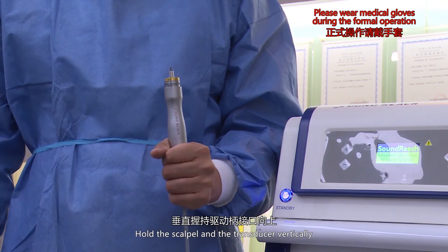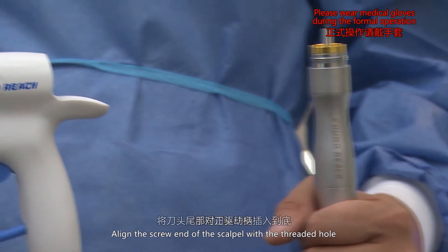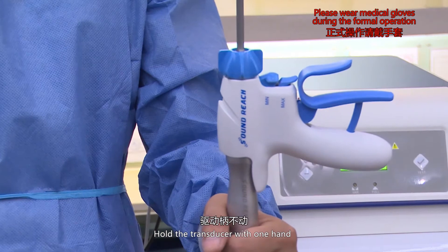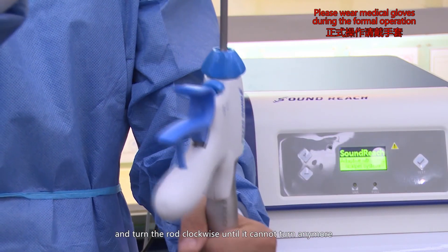Hold the scalpel and transducer vertically. Align the screw end of the scalpel with the threaded hole on the transducer head and then plug in.